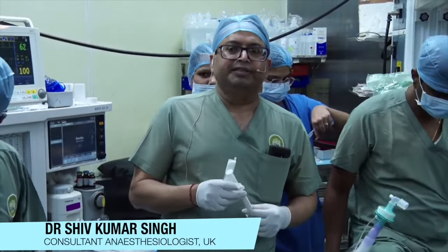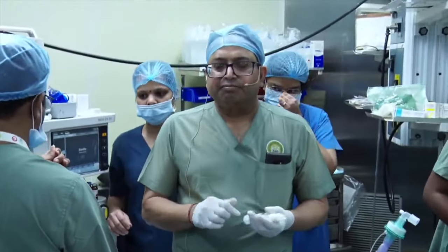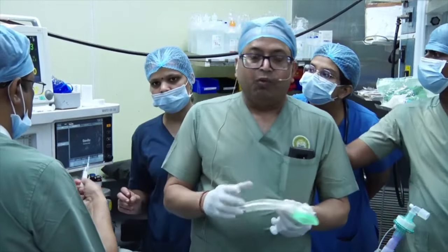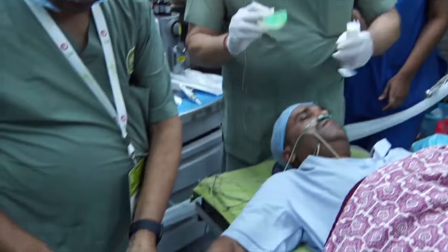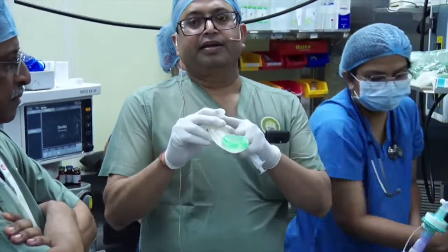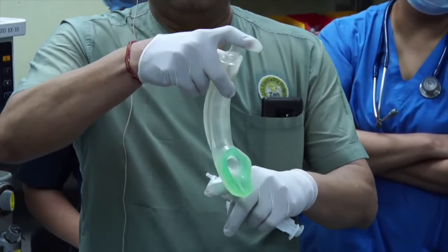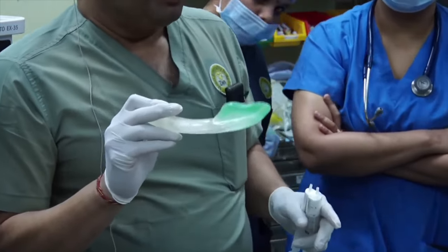We are going to demonstrate insertion of the iGel, a supraglottic device. Some people find it difficult, but here are the tricks. The way you hold the iGel is important — you need to hold it near where you attach your circuit, not in the middle. The reason is that as the iGel goes in and you apply pressure, it will likely bend and just click in. That is the biggest mistake I've seen people make.